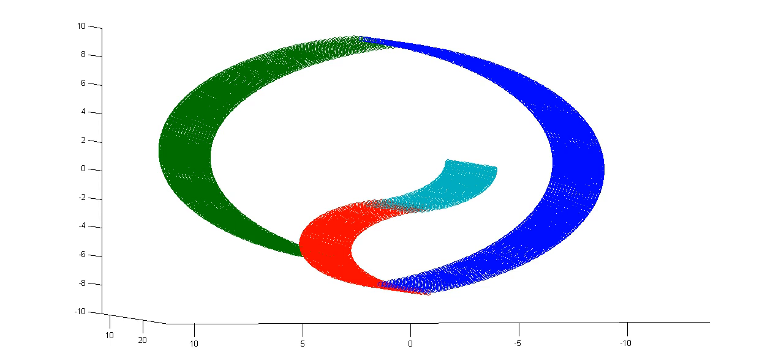Basically, another thing worth knowing about is that when you use a scanner to conduct one of these experiments, the quality of the scanner has to do with the strength of the magnetic field. A more powerful scanner corresponds to a stronger magnetic field that can be generated. And that allows you to get, in the same amount of time, a higher resolution image.